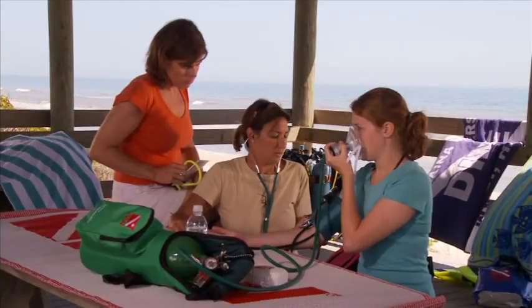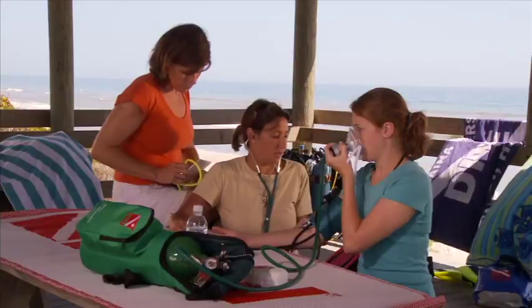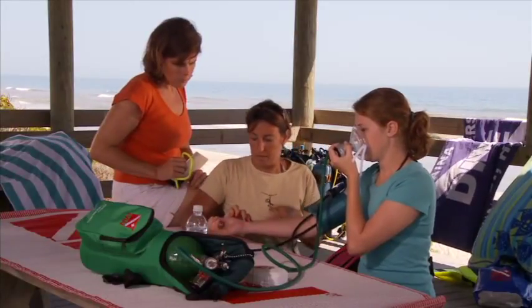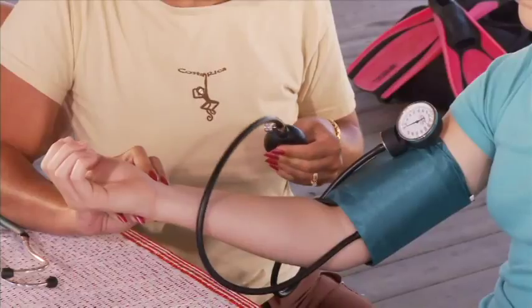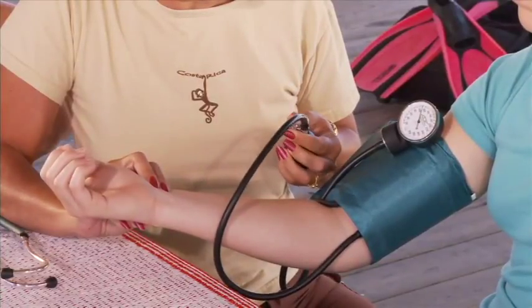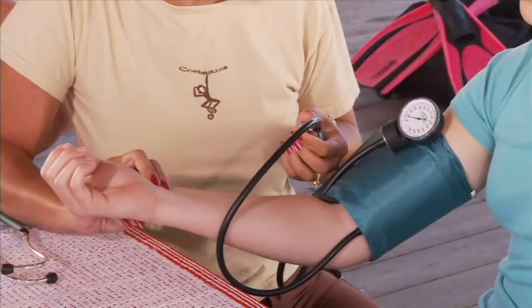The other technique for measuring blood pressure is by palpation, or feeling. This is a useful technique in settings where the situation is too noisy to measure the pressure by listening. To begin, find the radial pulse in the wrist. Inflate the blood pressure cuff until you can no longer feel the pulse. Remember that number, then continue inflating the cuff about 30 points higher. Slowly deflate the cuff until the radial pulse returns, and make note of that pressure.